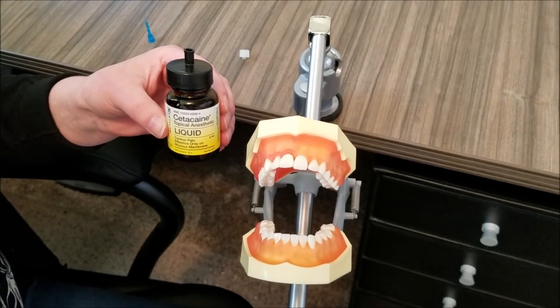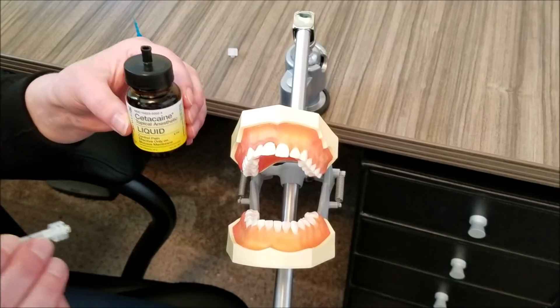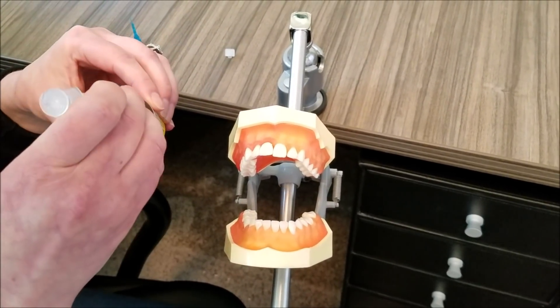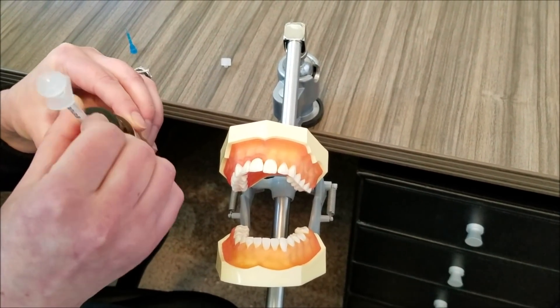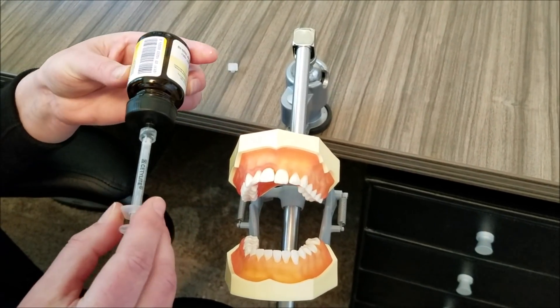Now let me show you how easy Cetacaine is to use by dispensing on my typodont here. I'm going to measure out a 0.2 milliliter dose and apply it drop by drop into the periodontal pockets with the micro capillary tip on the single-use syringe.